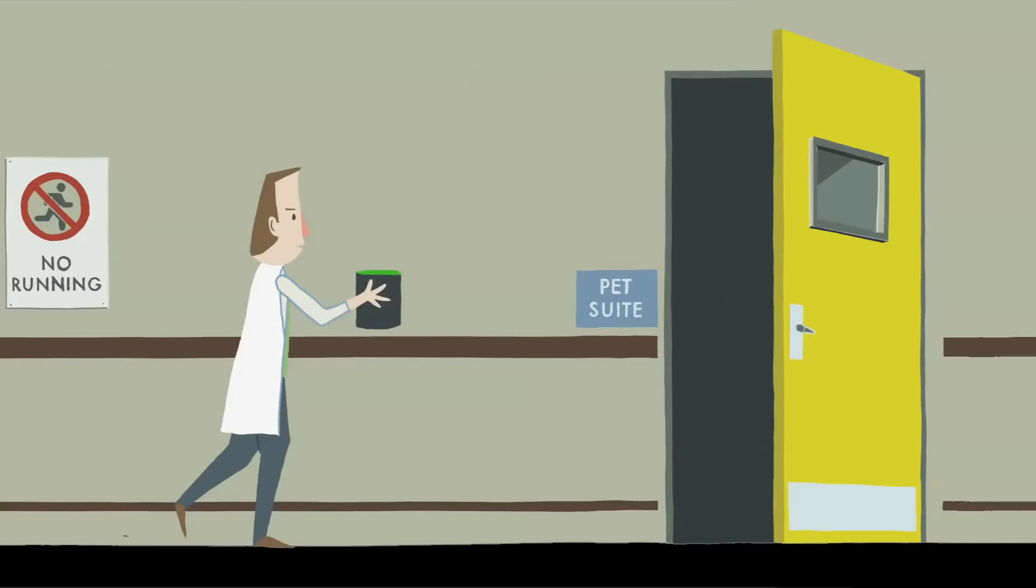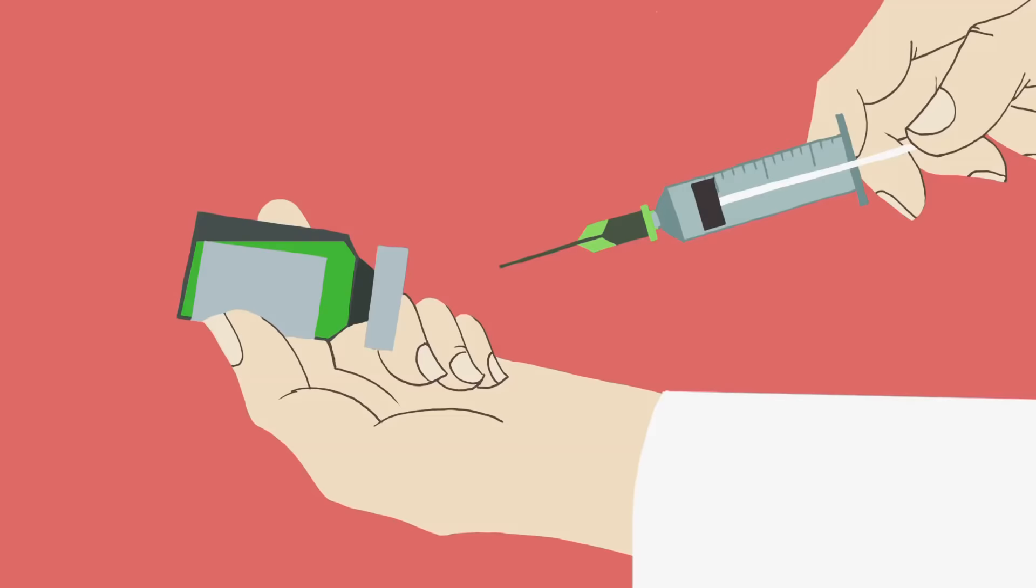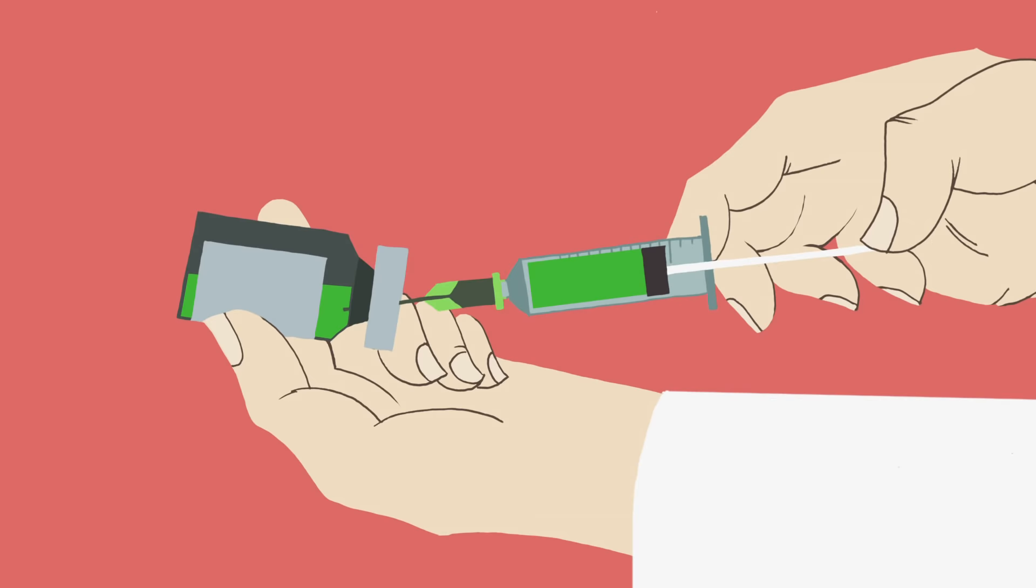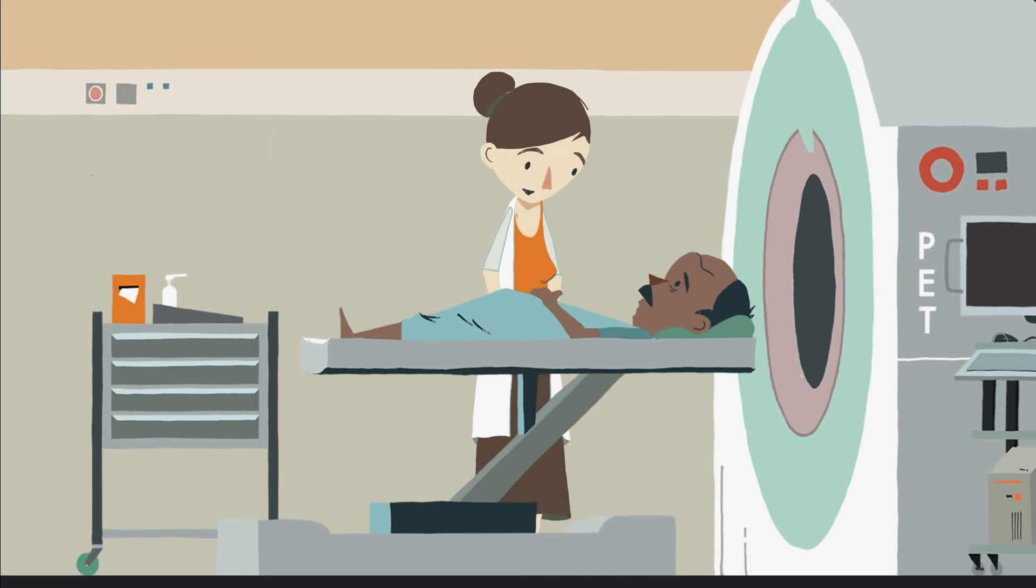The precious custom-made molecule is rushed to the PET clinic. Just the right level of radioactivity is measured out. Then it's injected into Dave's bloodstream. There'll be a sharp scratch.